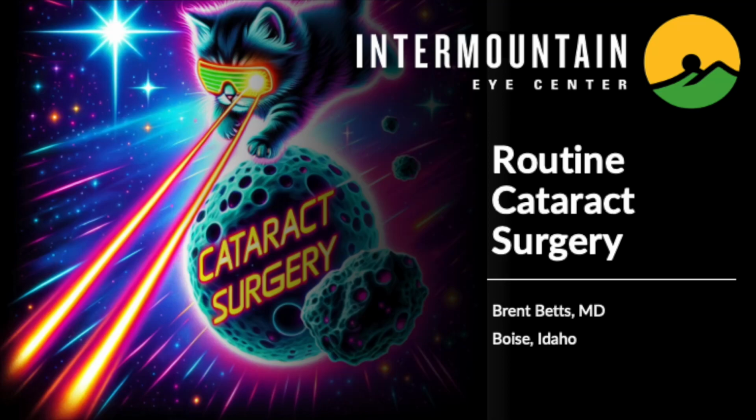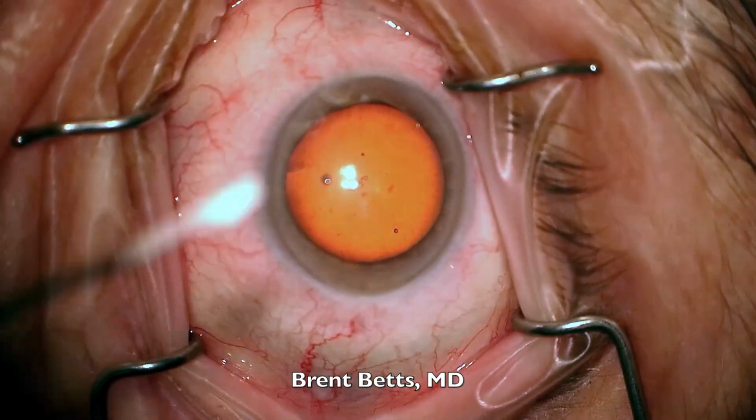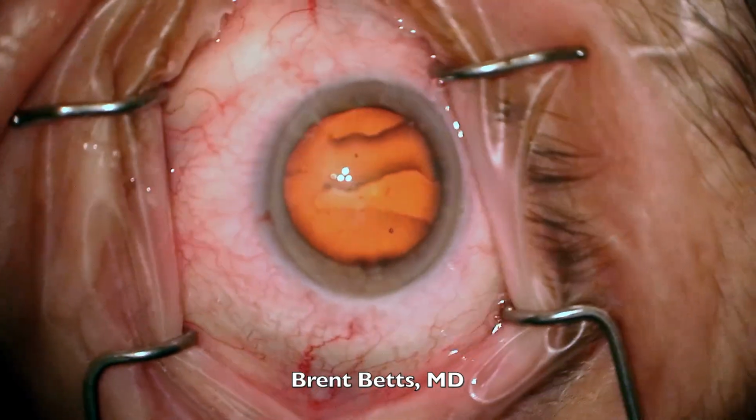Hi, this is Brent Betts showing a case of routine cataract surgery on a moderately dense cataract. The first step is to make a small incision, which we call paracentesis. It's parallel with the iris. The blade I'm using is 1.1 millimeters in diameter.